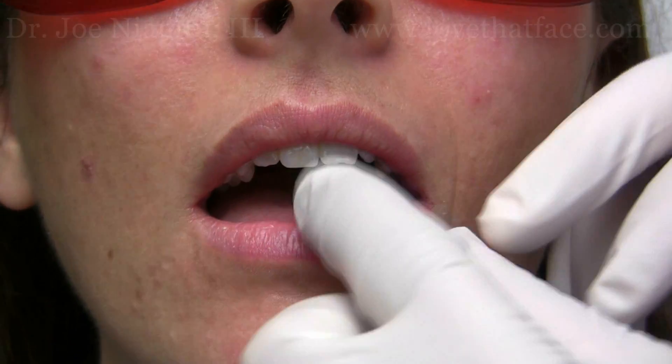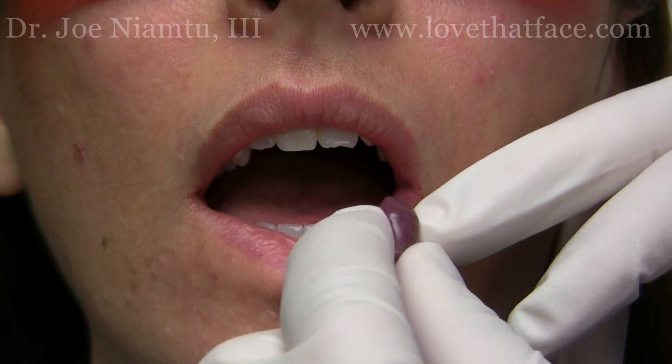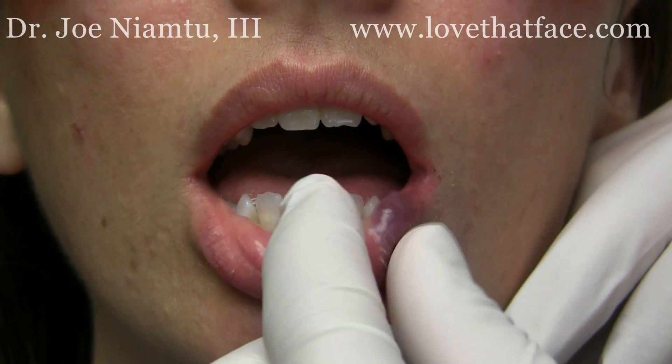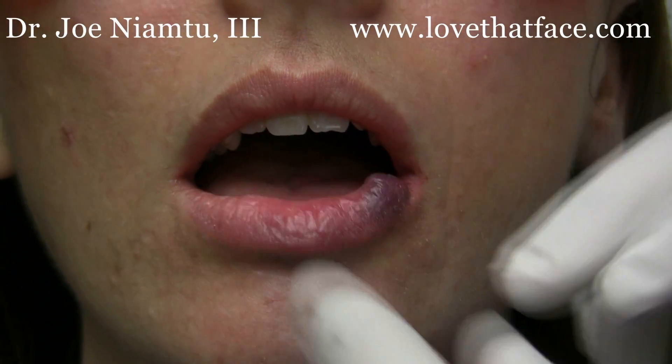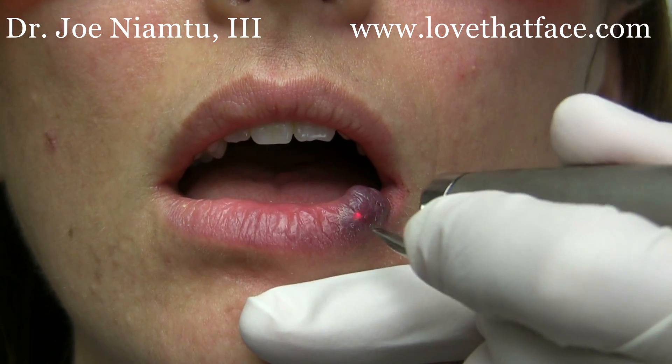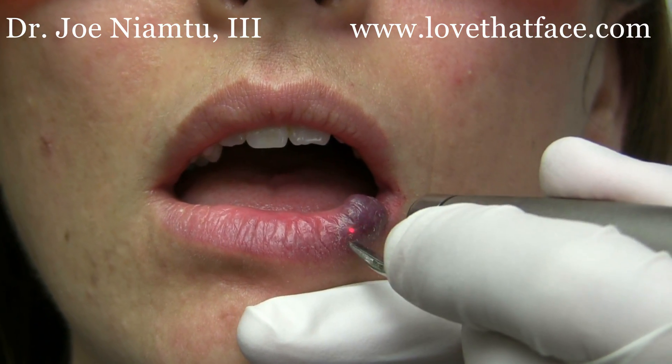Here's a patient with a large vascular lesion — a heme angioma or venous lake — and it's a good size one, so we're going to try and shrink this back and ablate the vasculature with the 940 wavelength.